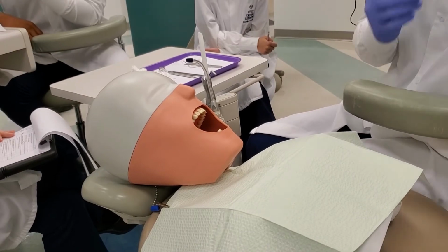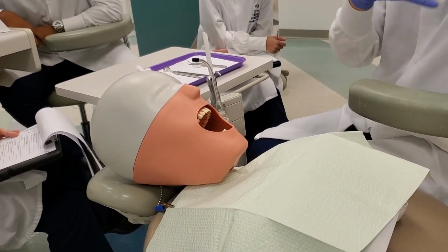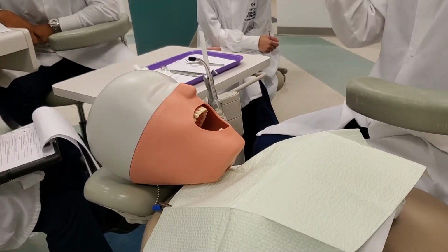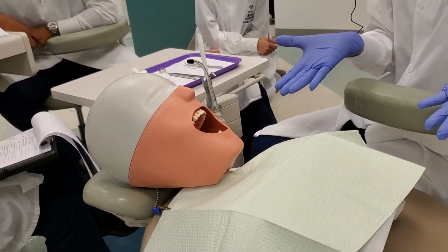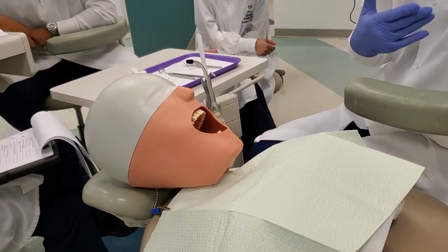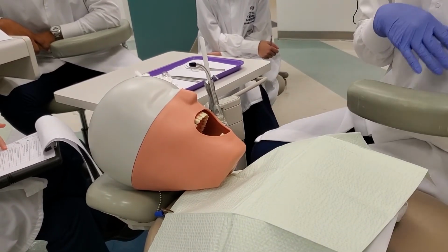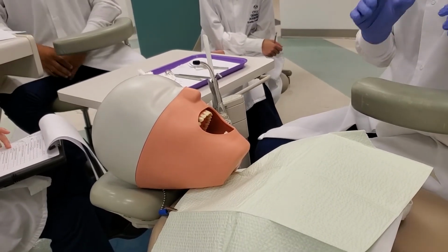And then whenever you take out any absorbents, usually there's debris behind it. They've been up there during the whole prep, so they'll have existing tooth, or if there was a restoration in the tooth already, or if there was a prep or anything. So there's going to be some debris in that mouth. So whenever you take out absorbents from a patient, always, always, always get in the habit of doing a limited rinsing technique to just make sure you have a nice clean area now.